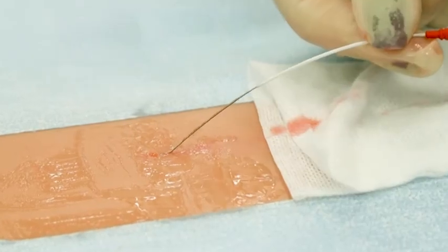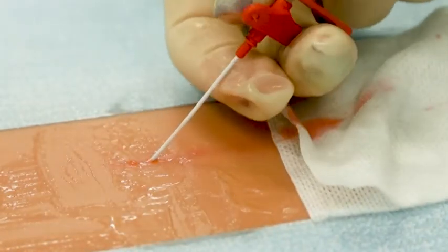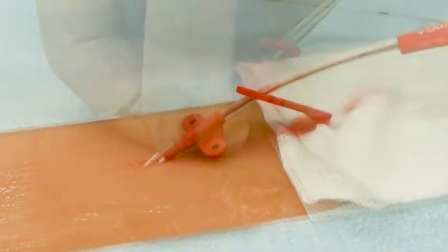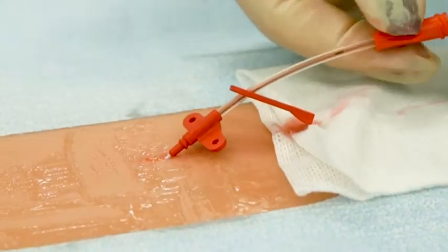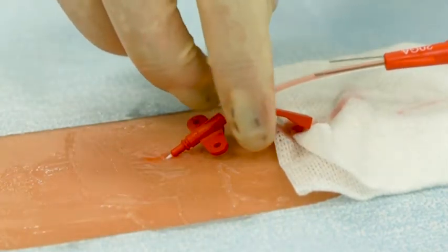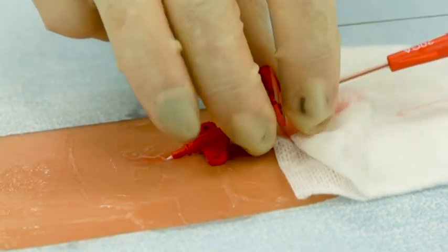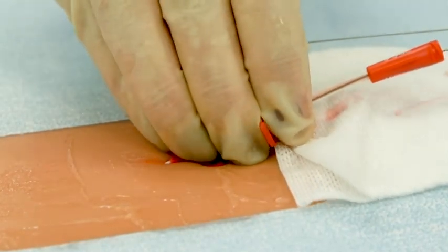Advance the catheter forward over the wire guide. Once the wire has exited the extension line, grasp the wire and continue to advance the catheter into position. Hold the catheter in place and remove the spring wire guide assembly. Pulsatile blood flow should be visible at the end of the catheter — this is a positive arterial placement.